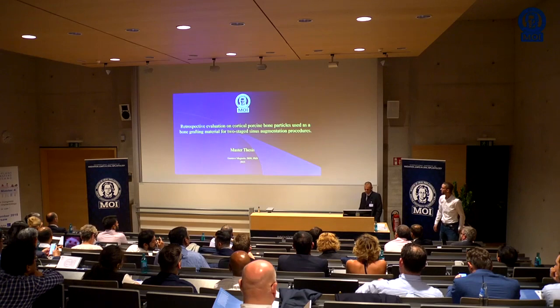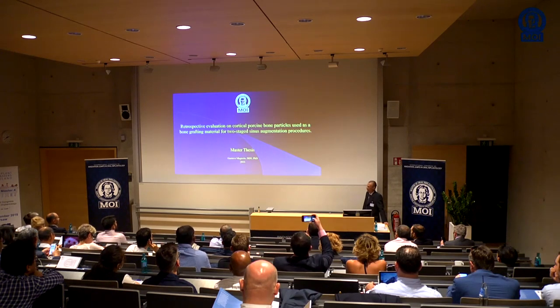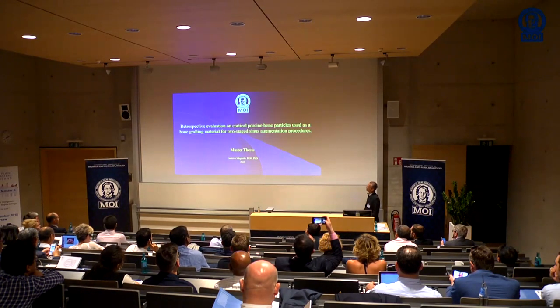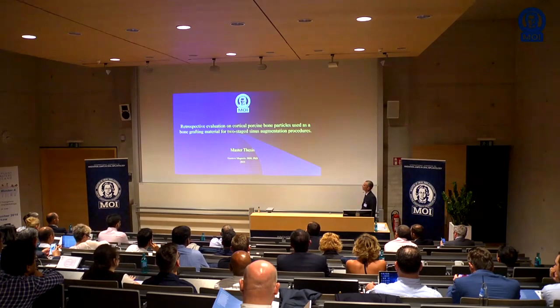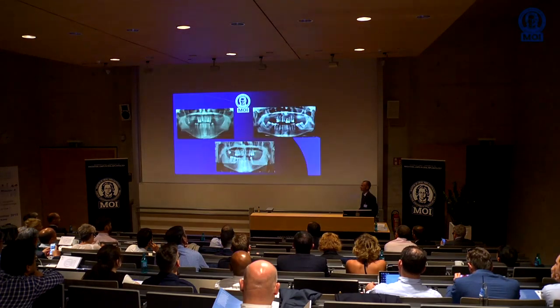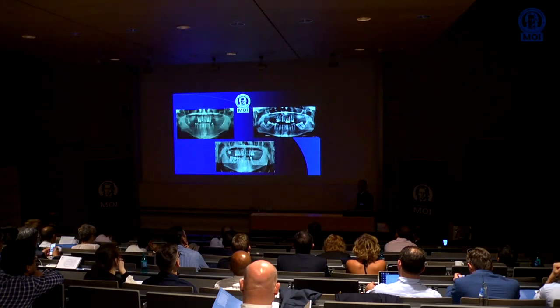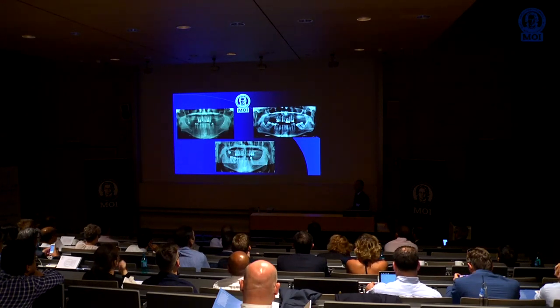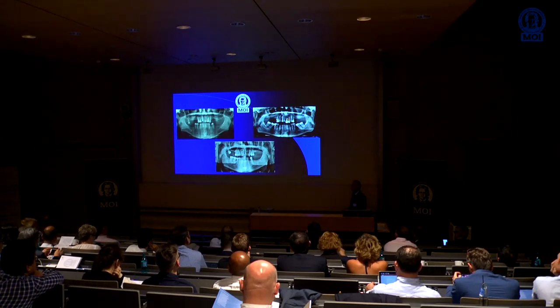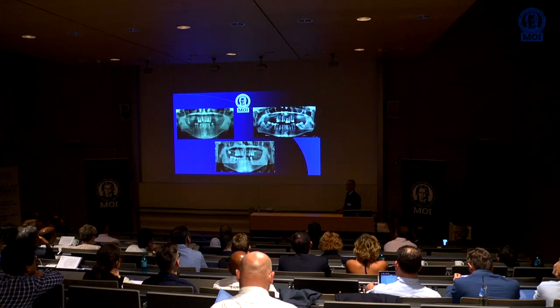So good afternoon. The topic I chose for my master thesis was a retrospective evaluation on cortical porcine bone particles used as bone grafting material for two-stage sinus augmentation procedures. As a brief introduction, I would like to say that restoring the posterior maxilla with fixed crowns and bridges can be very difficult and very challenging when limited amounts of bone are available and larger sinuses are present. In many cases, we know that the height of the available bone does not even allow for the placement of short or very short implants, which is to say 6 to 8 millimeter long implants.